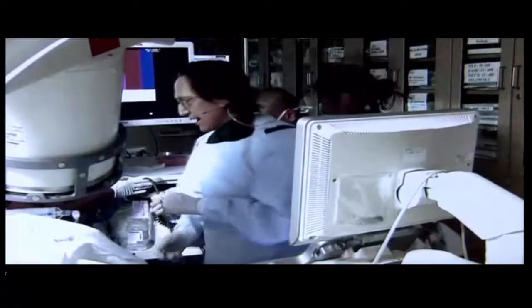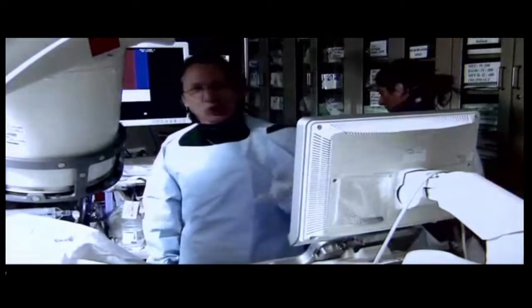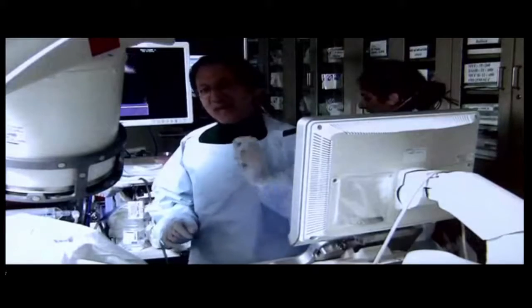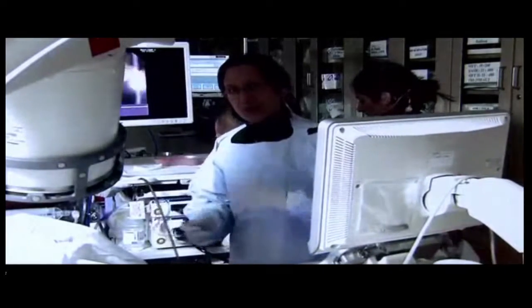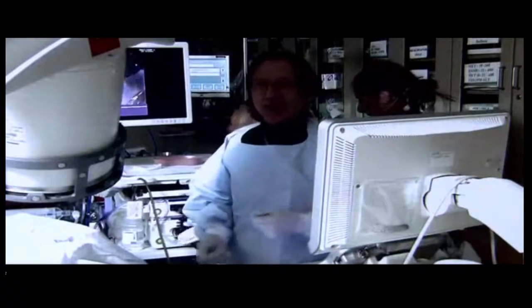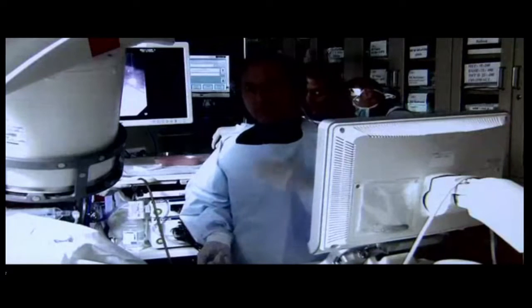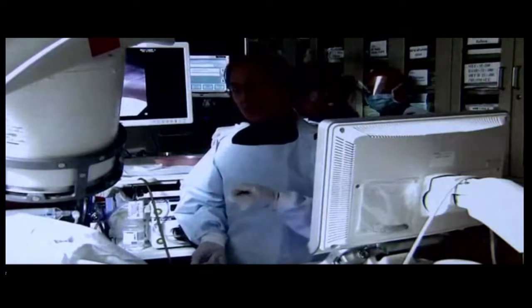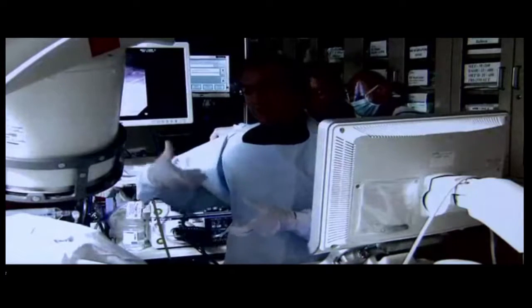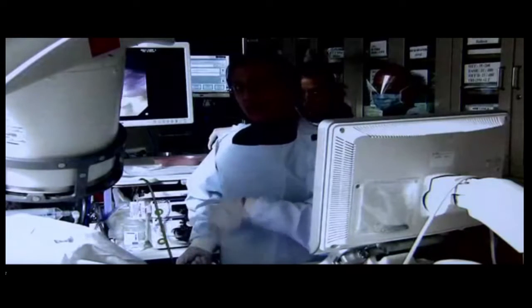So we'll try that out now. That scope, by the way, is a therapeutic scope. It has a 3.7 millimeter channel. It has another advantage. It has a water jet channel, so you can irrigate, something you cannot do with the curved linear array echo endoscope. Both the diagnostic and therapeutic do not have a water jet channel. That means if you want to irrigate, let's say you have some bleeding, then you have to flush it manually through the biopsy port. So here you can hook it up to your water pump and you can irrigate.